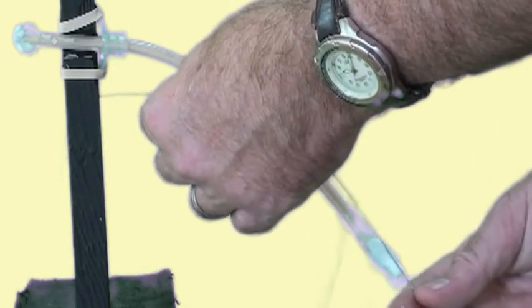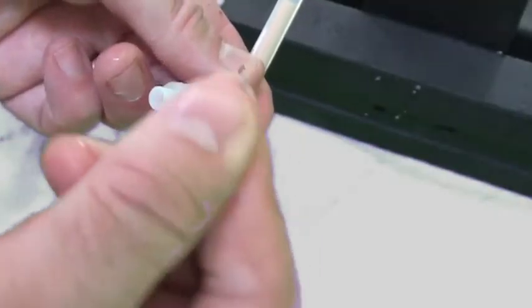I basically measure the wire from the outside of the tube all the way up to the abdominal wall. Then I add on about 2 centimeters of length. This should keep the entire length of the wire within the plastic tubing so it never contacts any human tissue. That seems pretty safe to me. Then you just gently tap the clog over and over. You can even do sort of a twisty, cranky motion like this. It can take up to 15 minutes to disrupt the clog, but then it'll finally flush through.